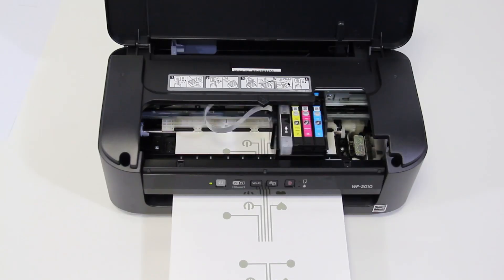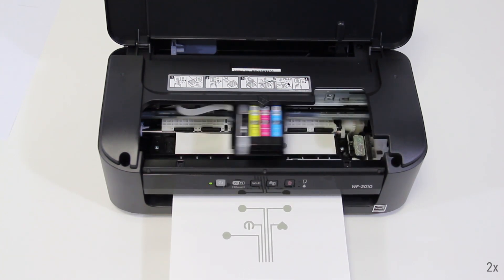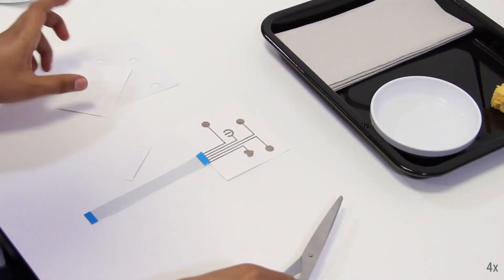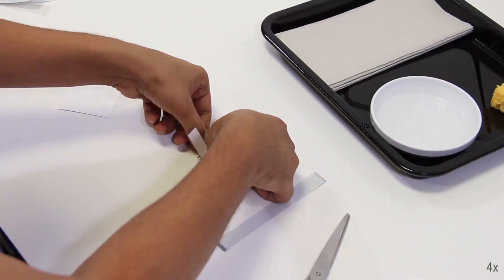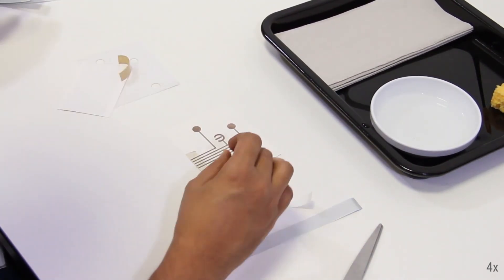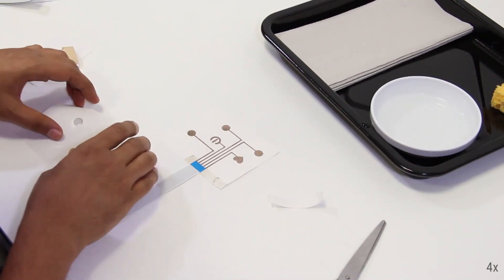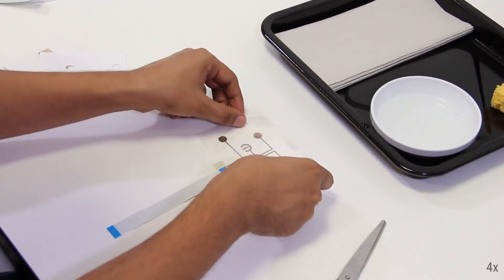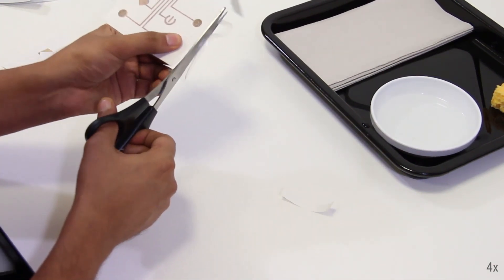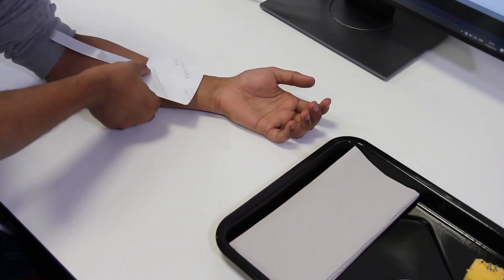The design is printed using an off-the-shelf desktop printer filled with conductive and insulating inks. The printed design is then heat cured. Wires for readout can be connected using a conductive Z-axis tape, and a laser cut adhesive is then applied onto the device leaving electrodes uncovered. The device is then transferred onto the body.